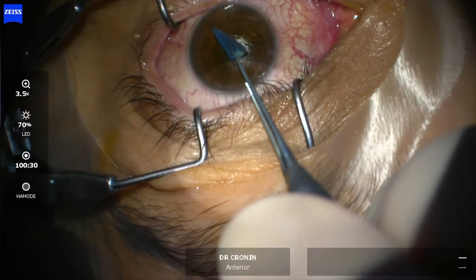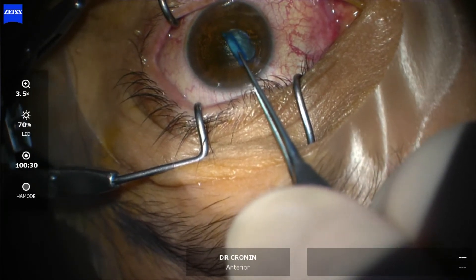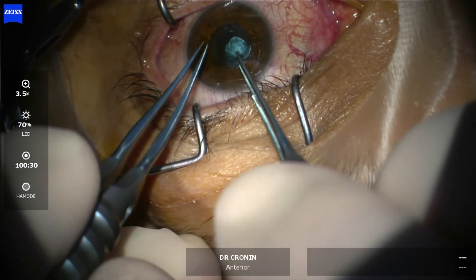You can see here it's been trephinated into a little six millimeter disc, and I'm going to place this on top of the patient's cornea. The epithelium, or the skin of the eye, needs to be removed before this is done. That can be done with a laser or generally just wiping it away, and you can be asleep while the procedure happens.